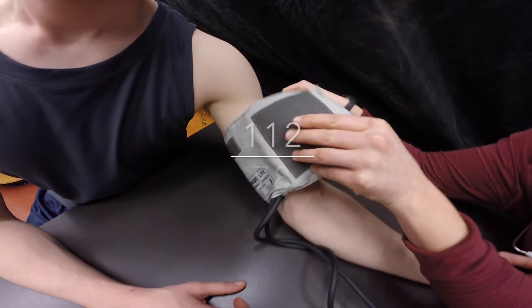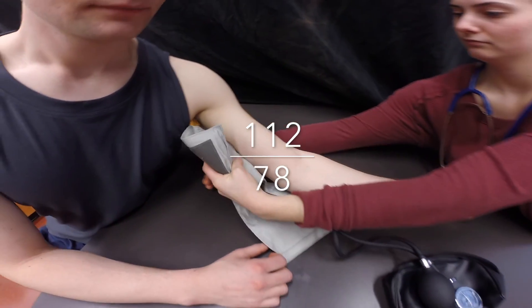Record these two numbers to the nearest 2 mmHg — the more accurate the better. If systolic is greater than 144 or if diastolic is greater than 94, wait an additional 5 minutes and repeat the process. If after that time it is still over, then you'll need a physician's approval to continue.